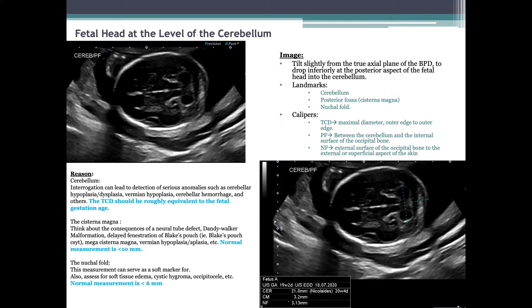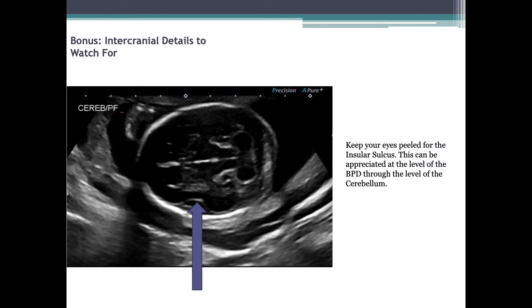The cisterna magna is located between the cerebellum and the dorsal surface of the medulla oblongata — this is where CSF produced in the ventricular system drains via the fourth ventricle. This allows insight into system functionality. Consider consequences of neural tube defects, Dandy-Walker malformation, delayed fenestration of Blake's pouch (Blake's pouch cyst), mega cisterna magna, and vermian hypoplasia or aplasia. Normal measurement is less than 10 millimeters. The nuchal fold measurement can serve as a soft marker with the highest consequence in aneuploidy analysis, carrying an increased risk by a factor of 17 for trisomy 21. It is also an opportunity to assess for soft tissue edema, cystic hygroma, or occipitocele. Normal measurement is less than 6 millimeters. Keep your eyes peeled for the insular sulcus, appreciable at the level of the BPD through the level of the cerebellum.